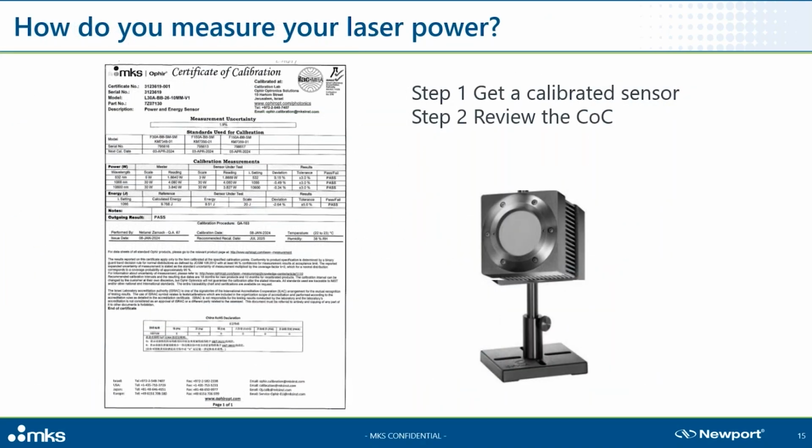So first things first, in general, you need to get a calibrated sensor. This means it has been tested and comes with a certificate. Make sure you understand the calibration procedure.